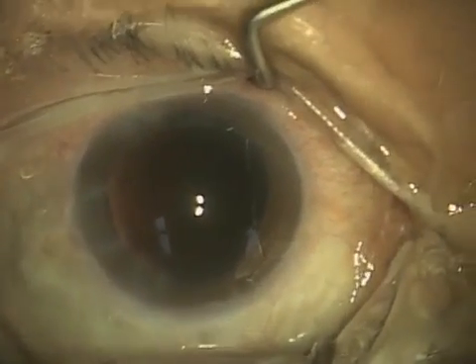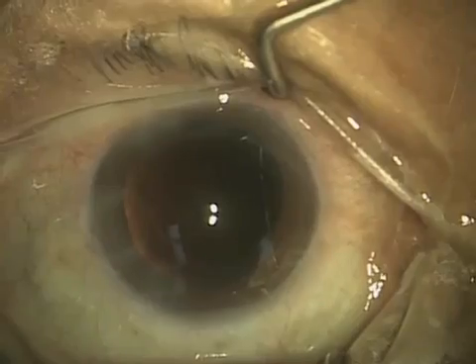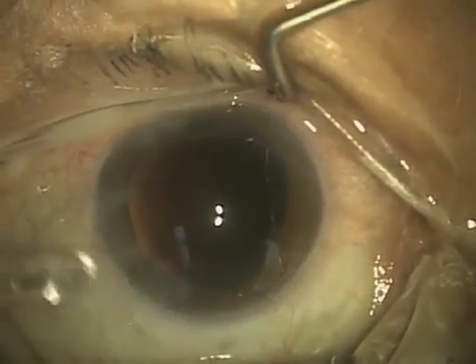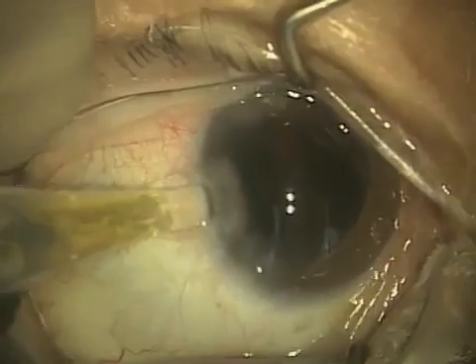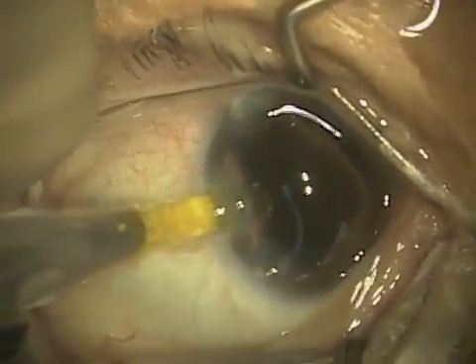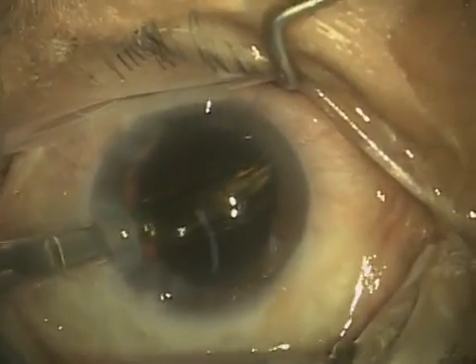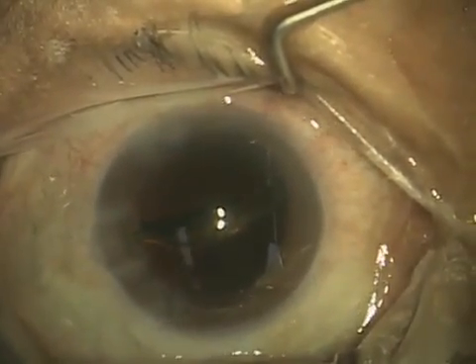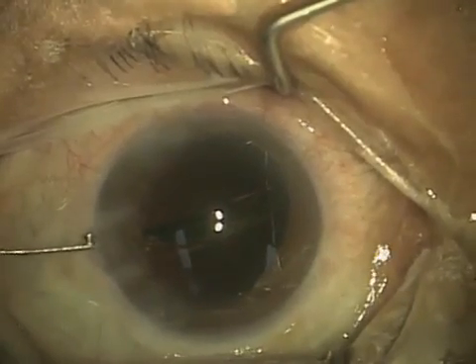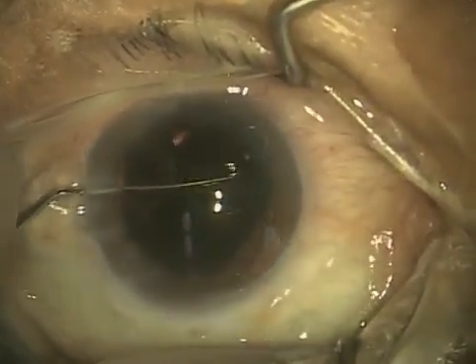In the last segment, I had just placed the viscoelastic into the anterior chamber, and now we are about ready to place the lens into the eye. This here is the lens insertion device, so I place this against the incision, and I actually use what's called wound assist, which uses the incision to assist my delivery of the lens into the eye. This allows me to use a smaller incision size — again, 2.2 millimeters.